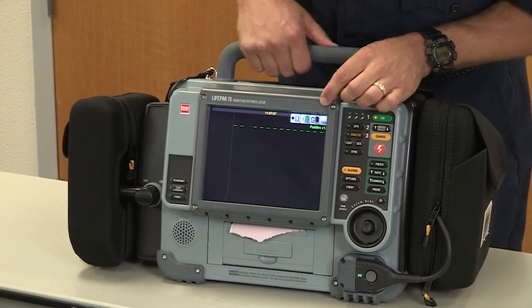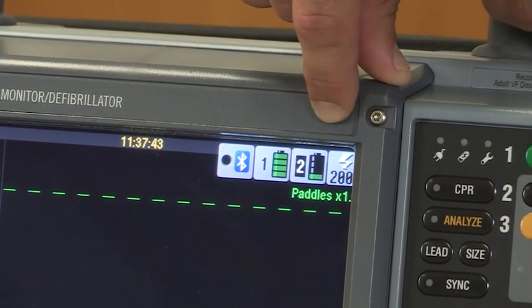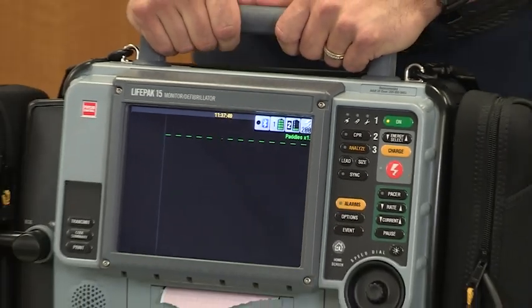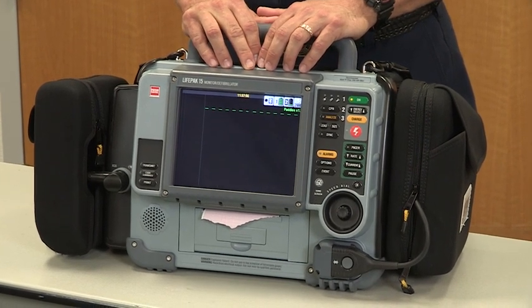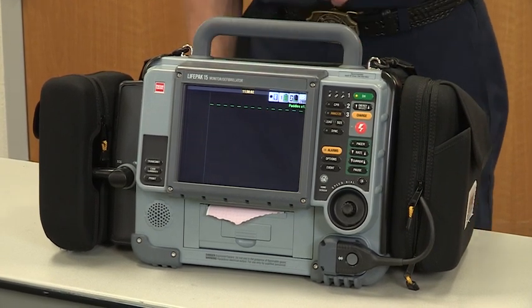One of the things you'll notice up here on the front of the screen, you'll see the battery indicators. You'll see the battery well 1 is full, battery 2 is down to less than 25%. One of the differences we're going to talk about are the fact that these don't have onboard charging systems. They simply have just batteries attached to them with a desktop charging system in the station. So it's imperative that we check to be sure that the batteries are full each day.